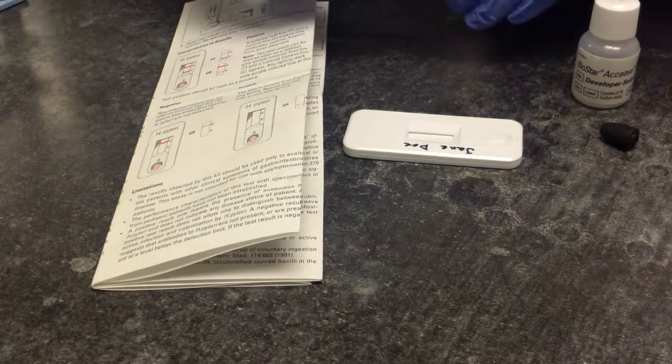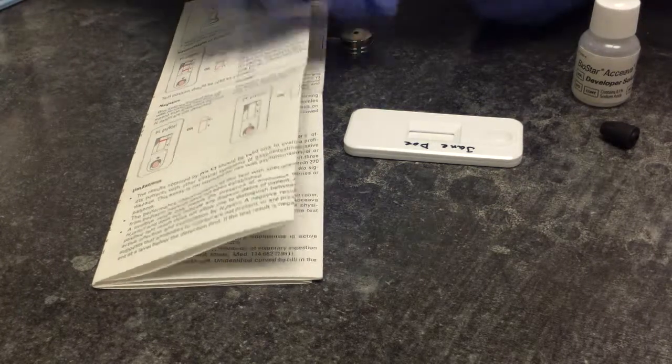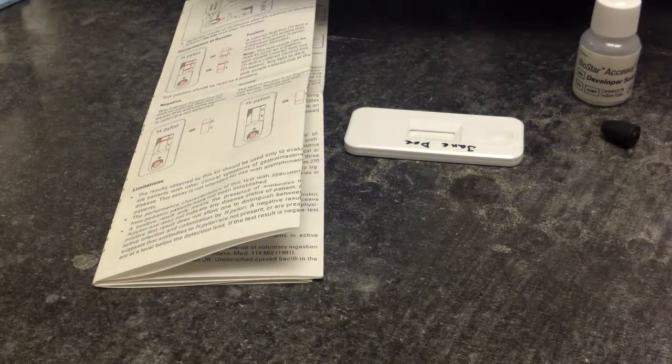We have some calibrated pipettes, which I'm going to make a fool of myself trying to get out of here. You have to take the little foam piece out of the top.